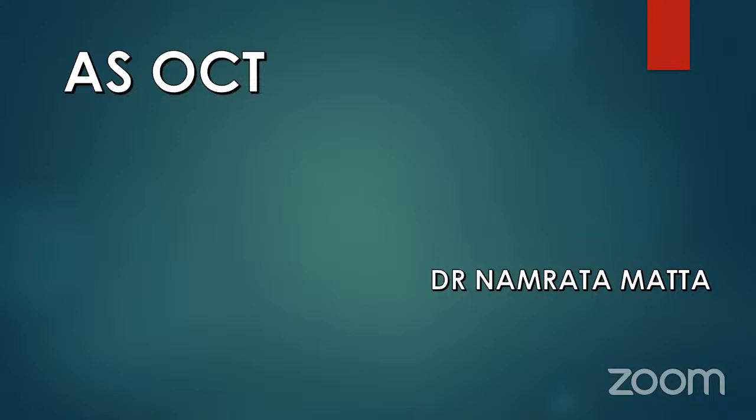Sir, in cases of keratoconus assessment, we can do epithelial mapping for subclinical keratoconus, or for depth in cases of trans PRK, sir. So in early keratoconus, what are the changes seen in epithelial thickness? There will be thinning corresponding. Yeah, it is said that the epithelial thinning is the first sign of keratoconus.